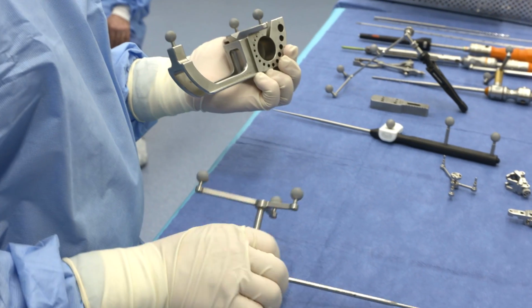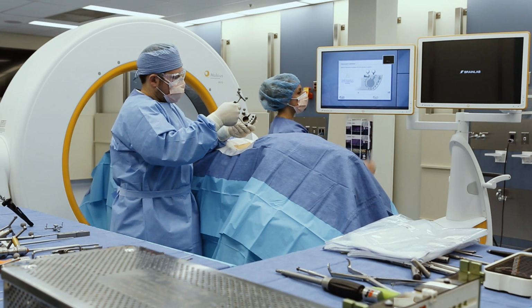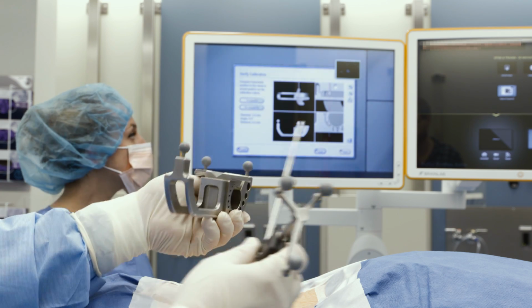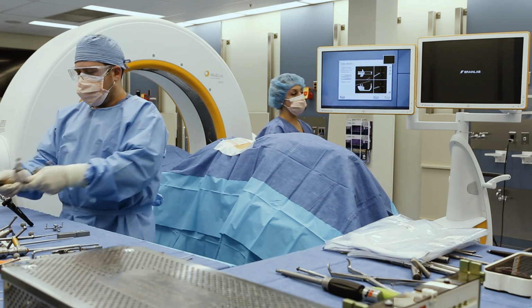One of the things that can be done is that the instruments can be calibrated anywhere along the procedure. And for us, it varies. So sometimes they're calibrated while we're positioning the patient, and the nurse will calibrate the instruments at that time. There are other times that it may be done while we're prepping and draping, or it could be done while we're exposing the spine, so that all that's done before we're ready to actually use them.